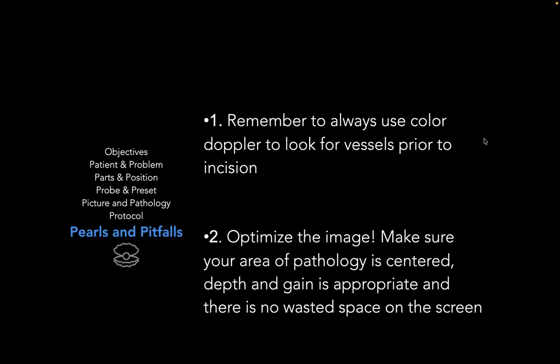So remember, some pearls and pitfalls. One is to always use color Doppler to look for vessels. And two, make sure to optimize the image using the depth and the gain appropriately.